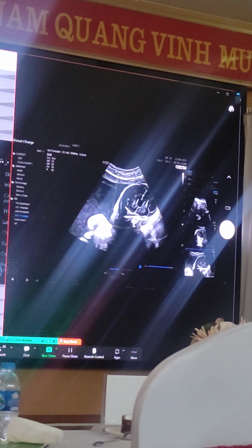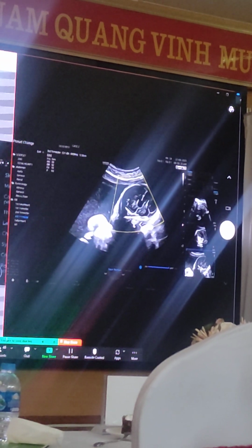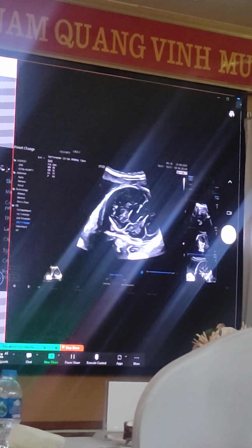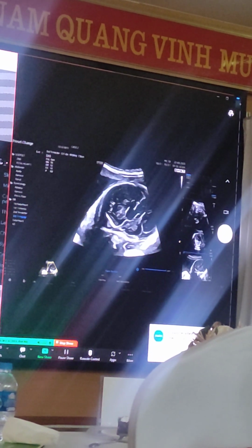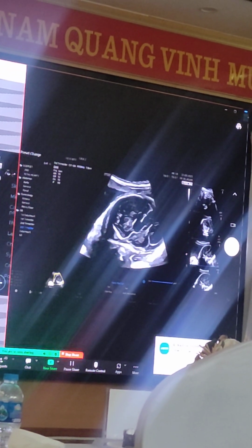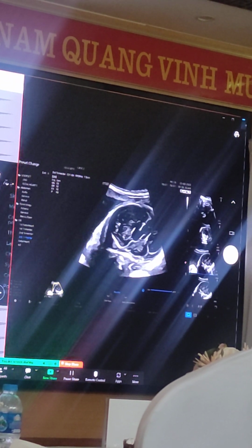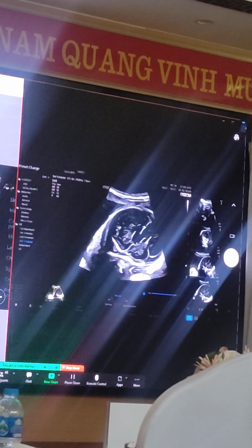if you don't pay attention to whatever is aneuploidy, then the next thing will probably relate to what we're looking at, which is suspicion of either CHARGE syndrome or DiGeorge syndrome. Now, what you see here on this coronal very anterior view, you can see that the cavum septum pellucidum is quite large, so you will have to assess if it's really cavum pellucidum or else.